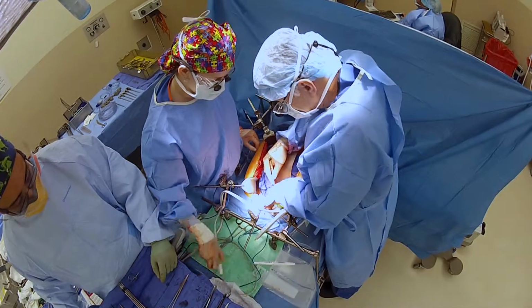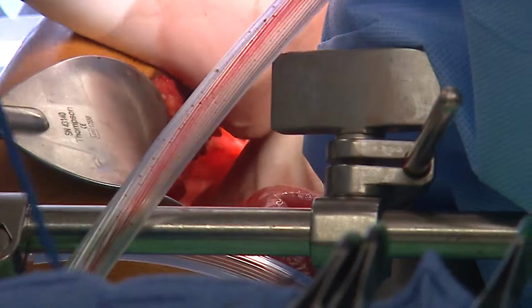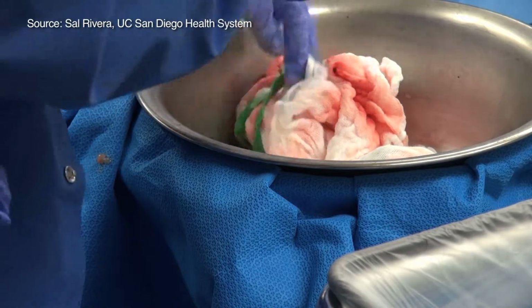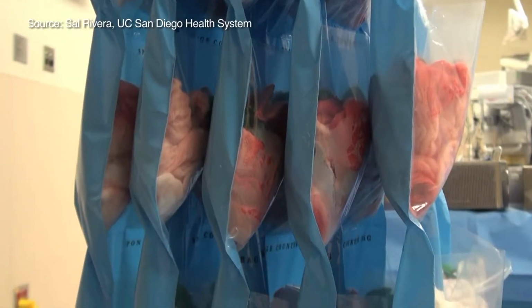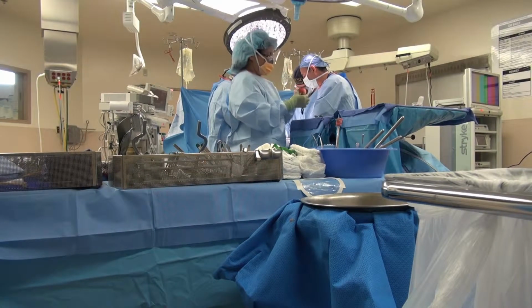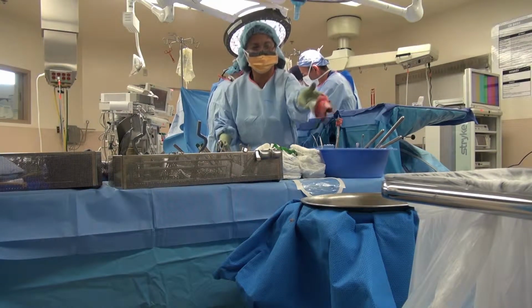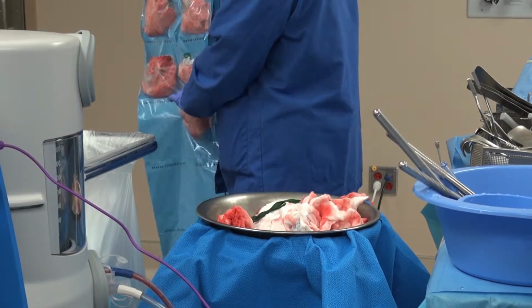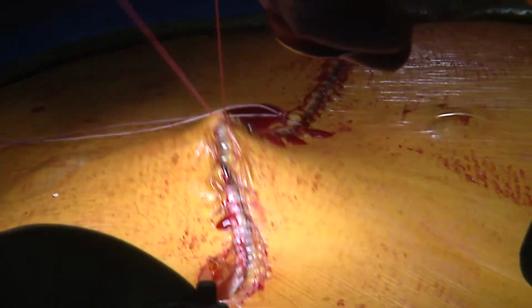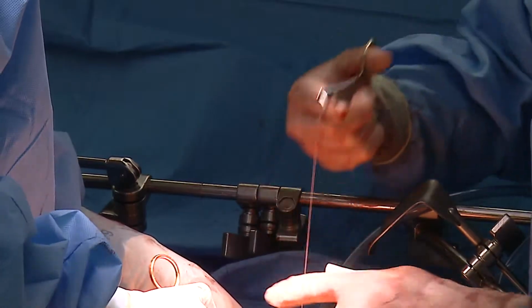One thing you can count on during surgery, there will be blood. Surgeons use superabsorbent towels, called sponges, to mop up blood and other fluids. Once they're soaked, the sponges are put in a receptacle. At the end of the procedure, nurses do a manual count of the sponges to make sure they're all accounted for. Only then is the patient finally sewn up and sent to the recovery room.